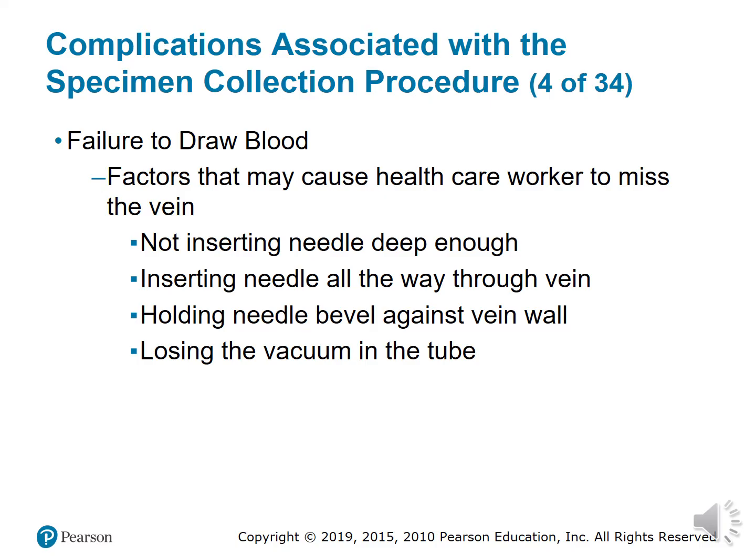You inserted the needle too far into the vein. Pull back a little bit, holding the needle bevel against the vein wall. If you feel a vibration in your needle, that means you're up against the cell wall, the vein wall. Pull back from it, and blood will start flowing into the tube.